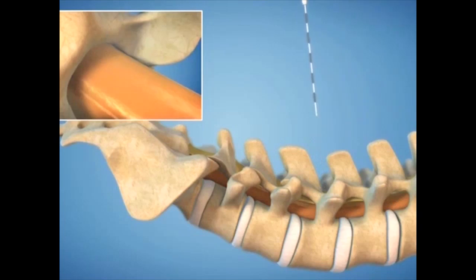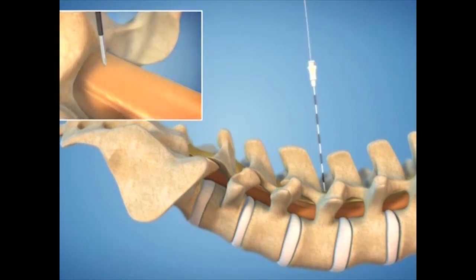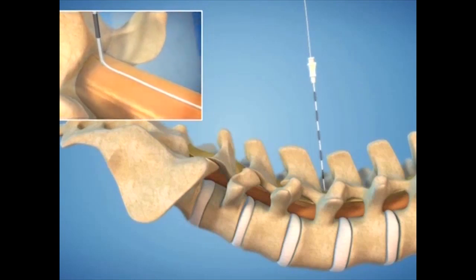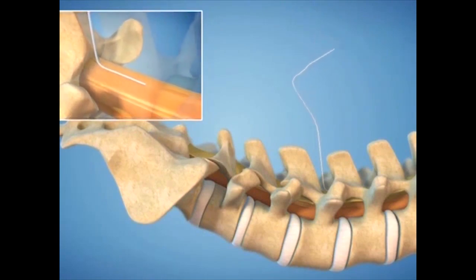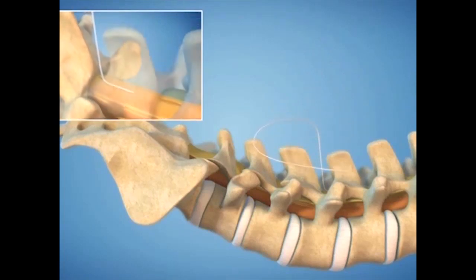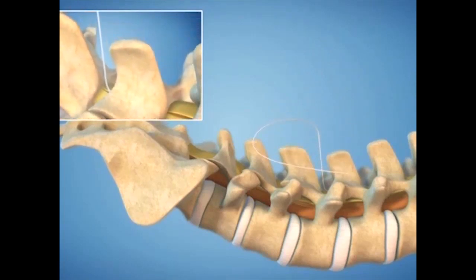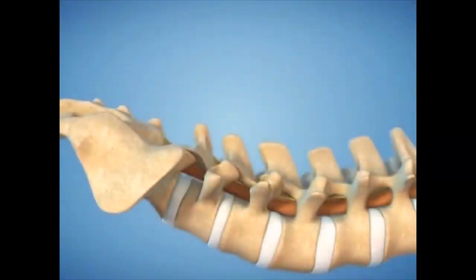The sharp bend in the catheter can also make withdrawal of the guide wire difficult in a catheter that is placed using a midline needle technique. Even if the catheter is successfully inserted and the guide wire withdrawn, catheter placement between the lumbar spinous processes or ligaments can lead to catheter failure. Over time, the spinous processes and ligaments may compress or abrade the catheter due to friction or pressure. This creates another potential cause for catheter fractures and breaks at the level of the lumbodorsal fascia.